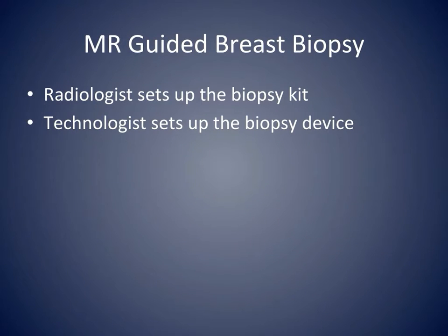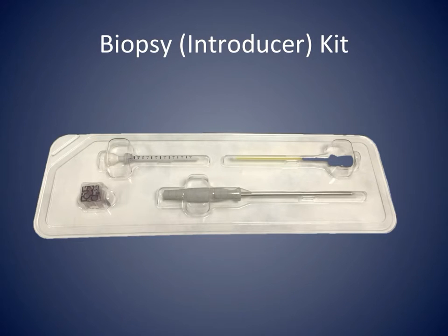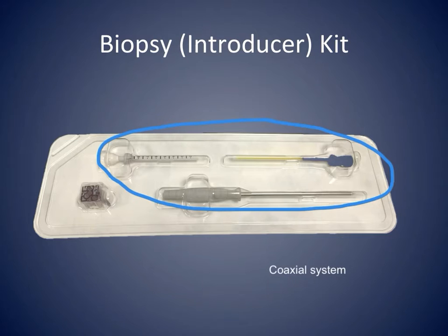Once it's confirmed that the biopsy will be performed, we need to set up the equipment. At our institution, the radiologist sets up the biopsy kit and the technologist the biopsy device. Various biopsy kits are made by different manufacturers. At our institution, we use the kit compatible with the BARD Core biopsy device. Most biopsy kits consist of a coaxial system and a needle guide.